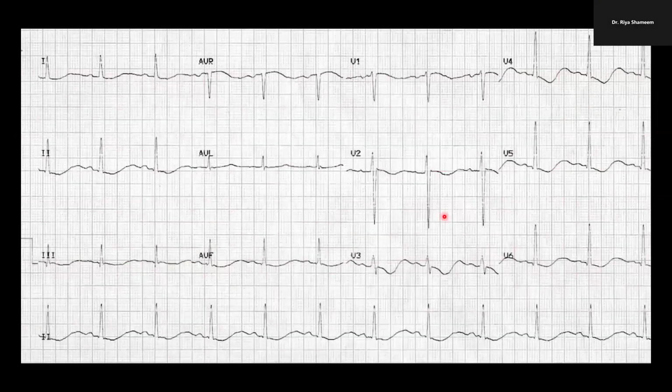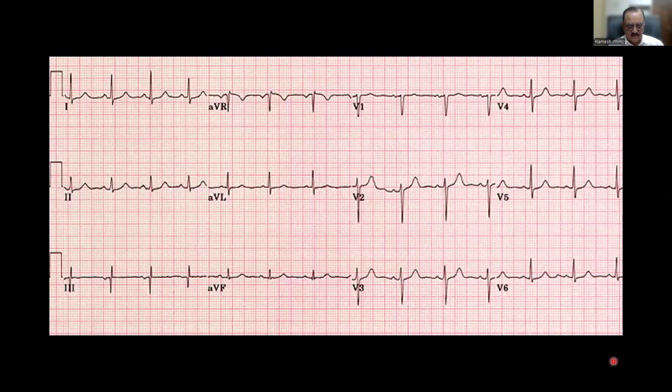Thank you. Okay. This T wave, anything? It's an inversion. It's definitely an abnormal T wave, right? It is opposite to the direction of the QRS. Any disease? There's a tall T wave in V2, V3. You mean this? Tall T waves. V2 is a small gray area which is sometimes equivocal. You cannot go by that. Yes, your observation is correct. Otherwise, other T waves are normal only. Only in V2 it looks slightly abnormal. But V2 is a transition zone. I'll tell you what the transition zone is later.